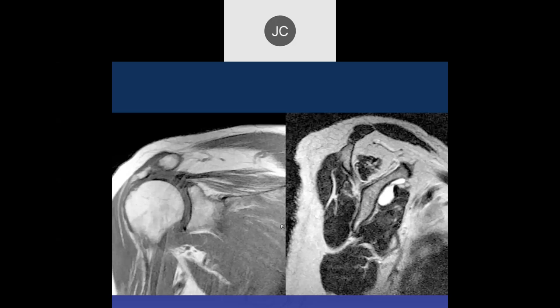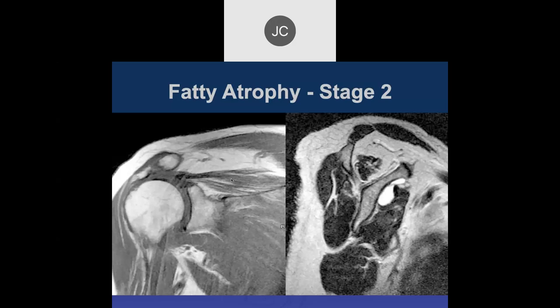Here's a full-thickness supraspinatus tear with retraction of the myotendinous junction. The muscle shows some fatty streaking — roughly Stage 1 to 2. If you see fatty atrophy isolated to the supraspinatus with all other muscles normal, it's significant because it probably indicates a chronic long-standing tear. The chronicity of the tear likely correlates best with scarring, whereas if all muscles show atrophy the fatty atrophy is less meaningful.